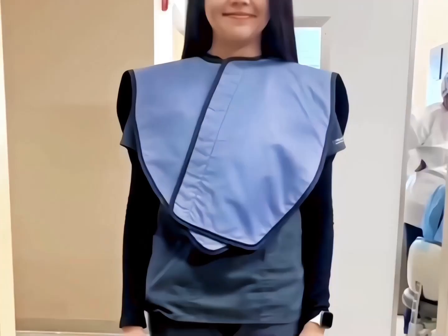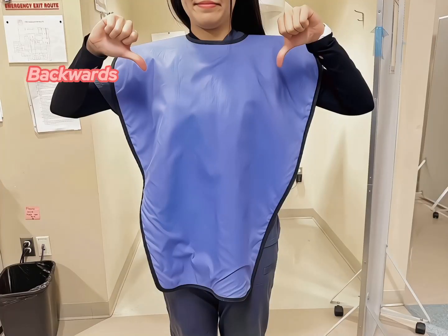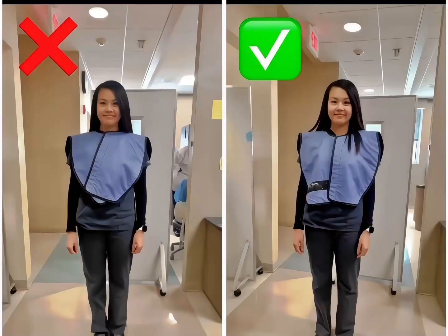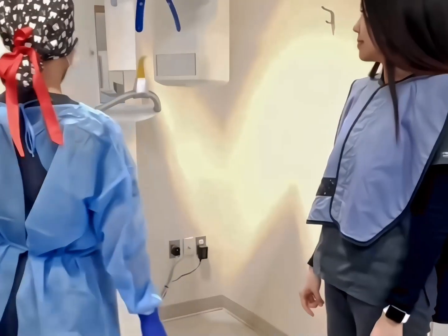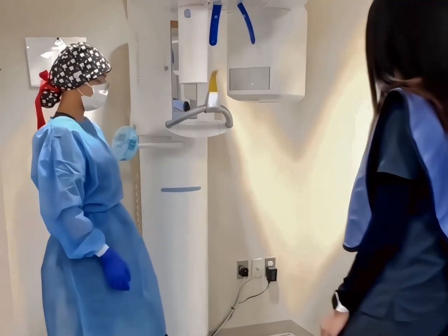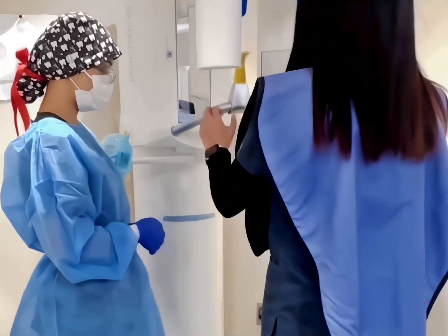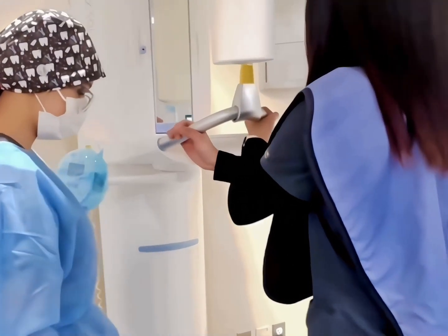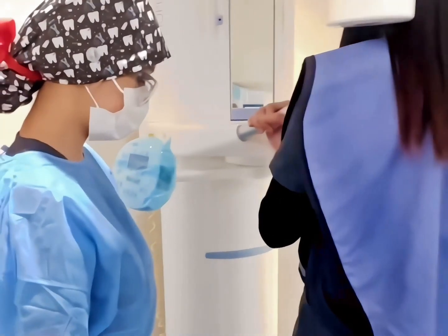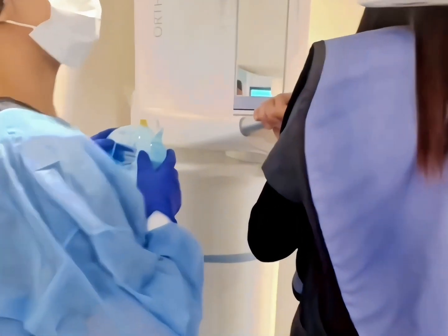When placing the lead apron, the clinician will assist the patient by putting it on from the back. Make sure the whole one-piece side is on the back and the two pieces are in the front like a cape, and should not be overlapped too much. Afterward, we will direct the patient to approach the machine, standing in front of the yellow bite block, using our foot as a guide for them, and we will ask the patient to stand with their shoulders back and as straight as possible, meanwhile crossing their hands to hold the handlebars.